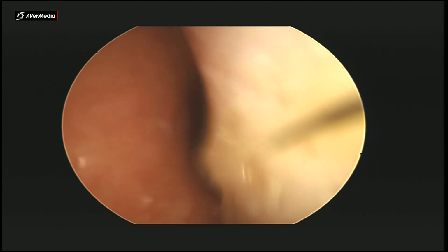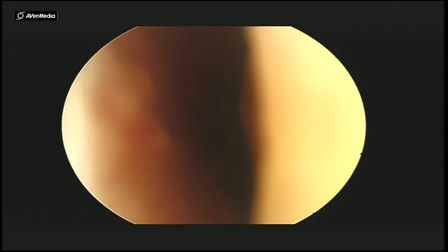So a little bit of decongestion I have achieved, and I'll try to negotiate the endoscope inside. As I'm trying to go inside, I can see the patient's inferior turbinate, which is kind of boggy, which is under hypertrophy. But what I can appreciate is that the patient is having a good airway inside. So it's only a severe deviation on the anterior side, and I can see something superior deviation as well, that is the high DNS. So this patient requires septoplasty.